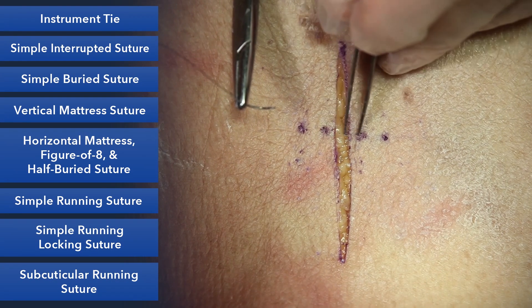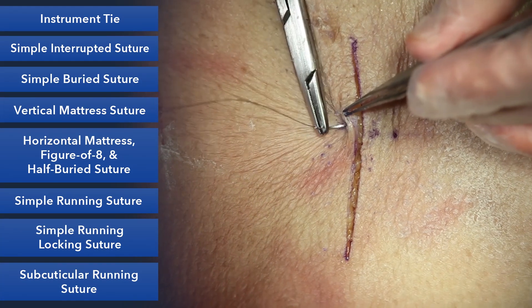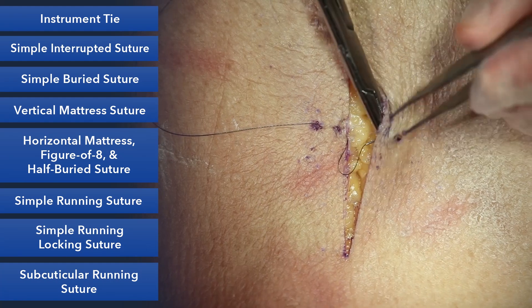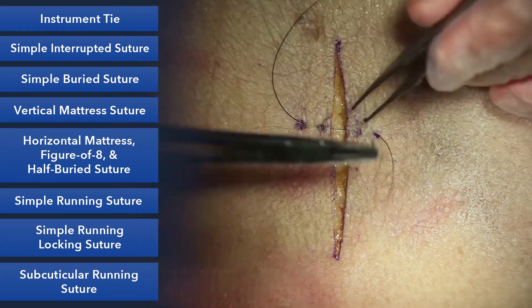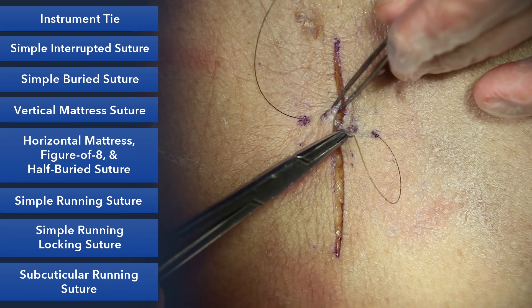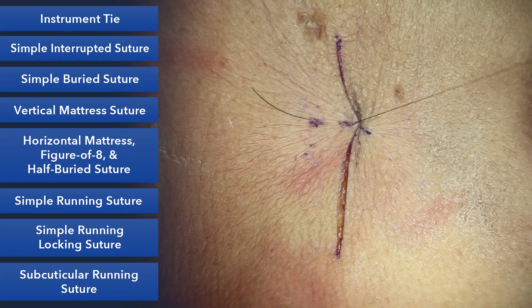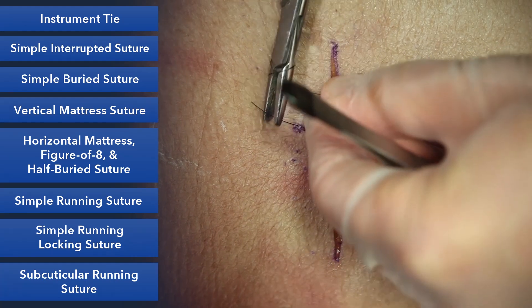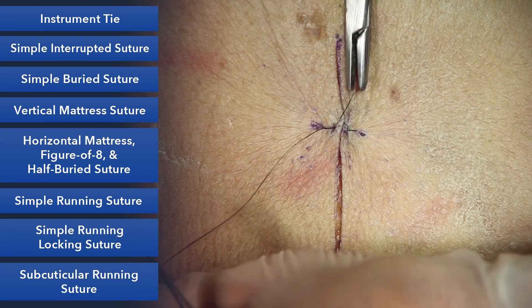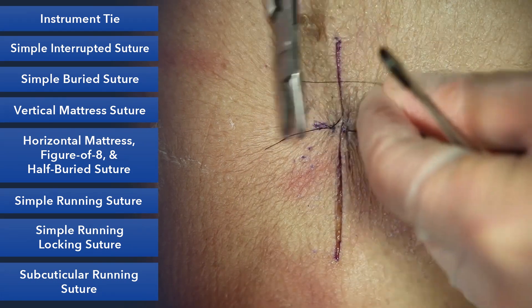A simple suture is really relying on a much smaller area. So we'll start far and travel under the skin, and the same thing on the other side, and we'll turn our needle around and now we'll go near and near. When we tie this down, it approximates and everts the skin edges, and we can make it just as tight as we want. So we have our granny knot, and we'll square our knots.